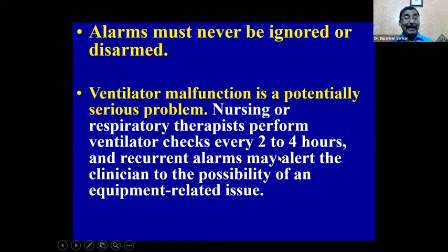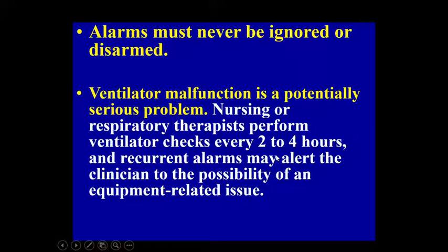Now, ventilator malfunction. I'm not talking about the patient malfunction or something. First, I'm coming to the machine itself because we know least about the machine. Ventilator malfunction is a potential serious problem because it's a machine and a machine can malfunction at any point of time.